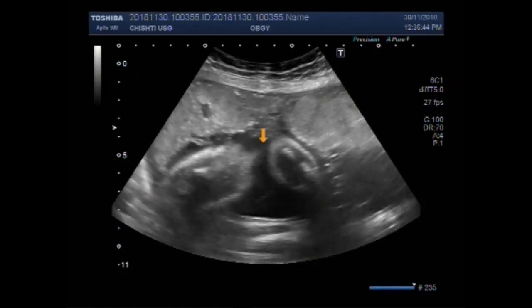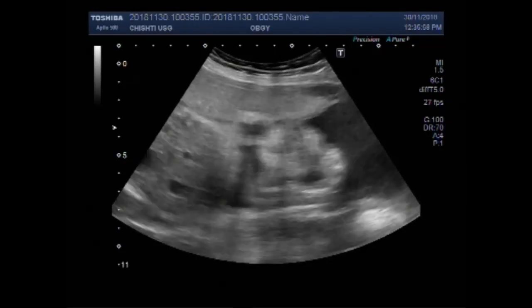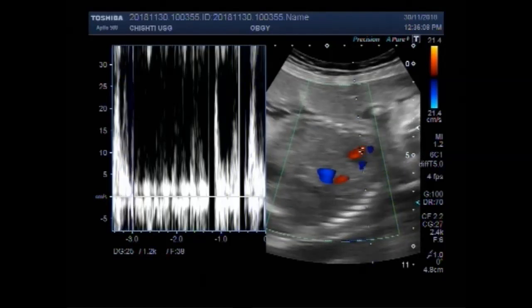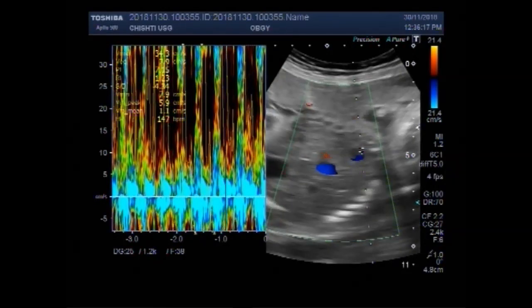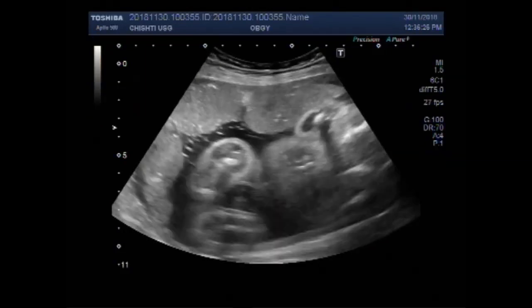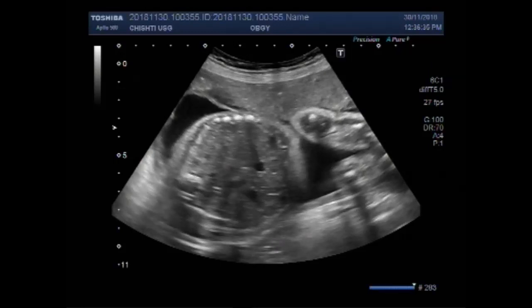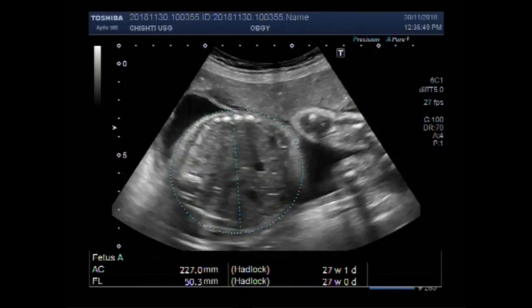This is a male fetus. This is the placenta. Fetal cardiac activity is visible and audible. Now you can see the measurement of abdominal circumference — it is about 27 weeks, one day gestational period.